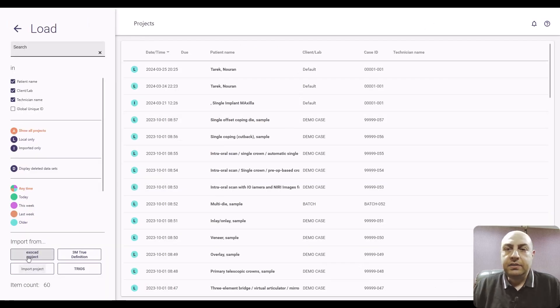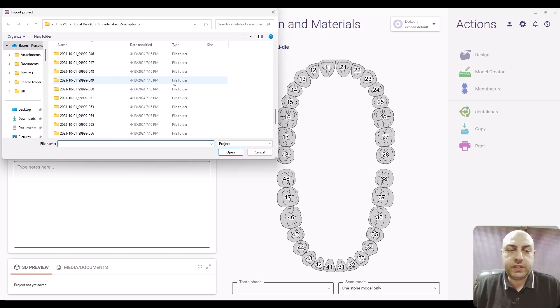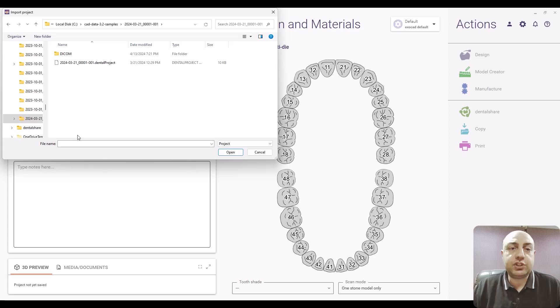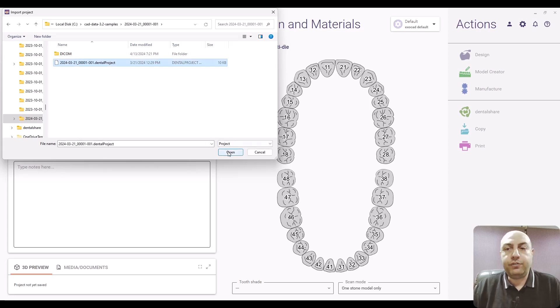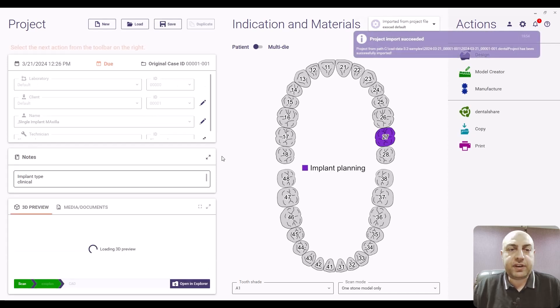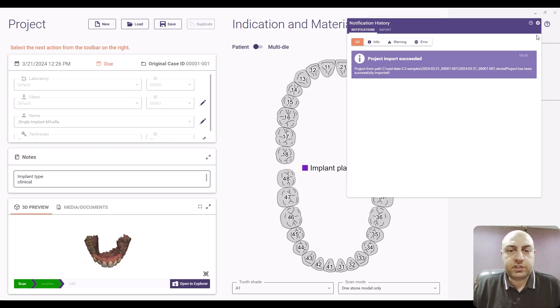And from there start to go to load a case, go to load and you can go to Exocad project to load an Exocad project and search for the name of the folder of your project and you will find the file that is necessary to import, click it.